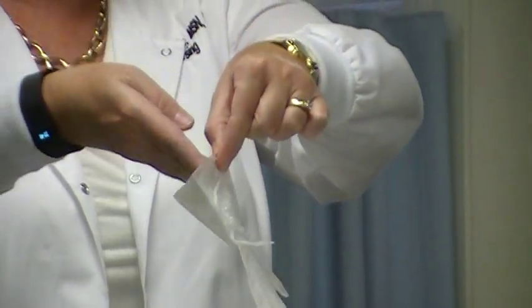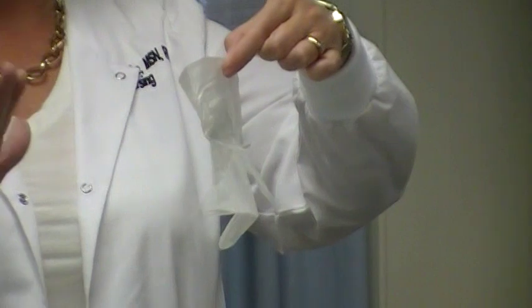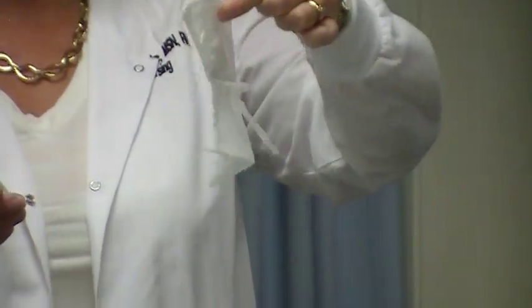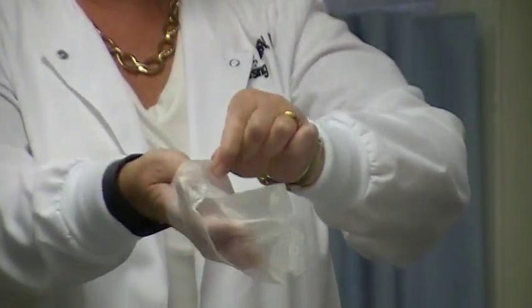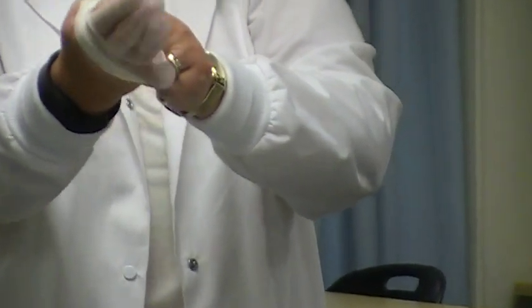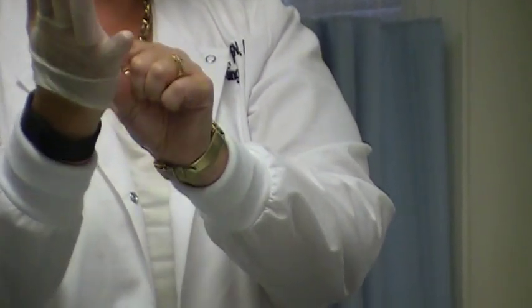Next, I'm going to place my hands gently, and you'll see that when I pick up the glove, one thing that I typically do is step back away from my table so that I make sure I don't hit this sterile glove on anything, and hold it up. You don't want to hold it down where it could drag on the table. So I hold it up, slide my hand in, and pull, again, just nice and slow, working your fingers in there, okay.